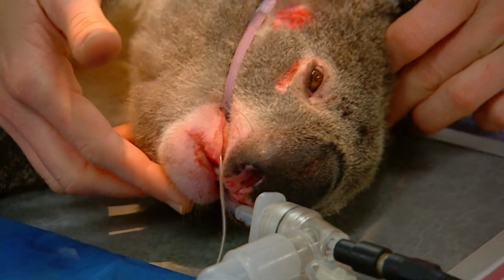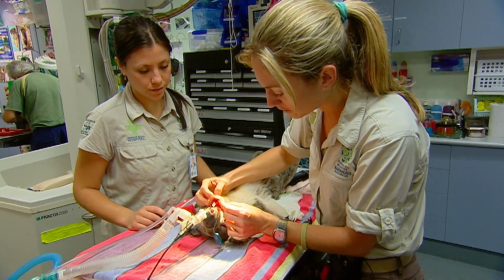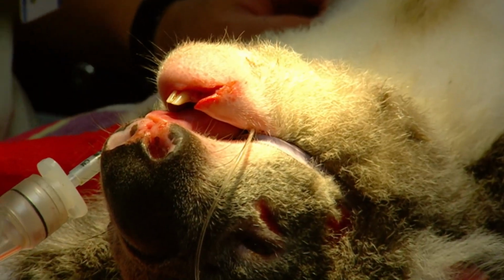He's in bad shape. Amber's named him Yoda. So he's got quite a nasty laceration down the bottom of his chin here. Basically, the gum and the bottom of his chin has been pulled off, the area of bone. I'm just going to X-ray his face just to see if we've got any fractures.